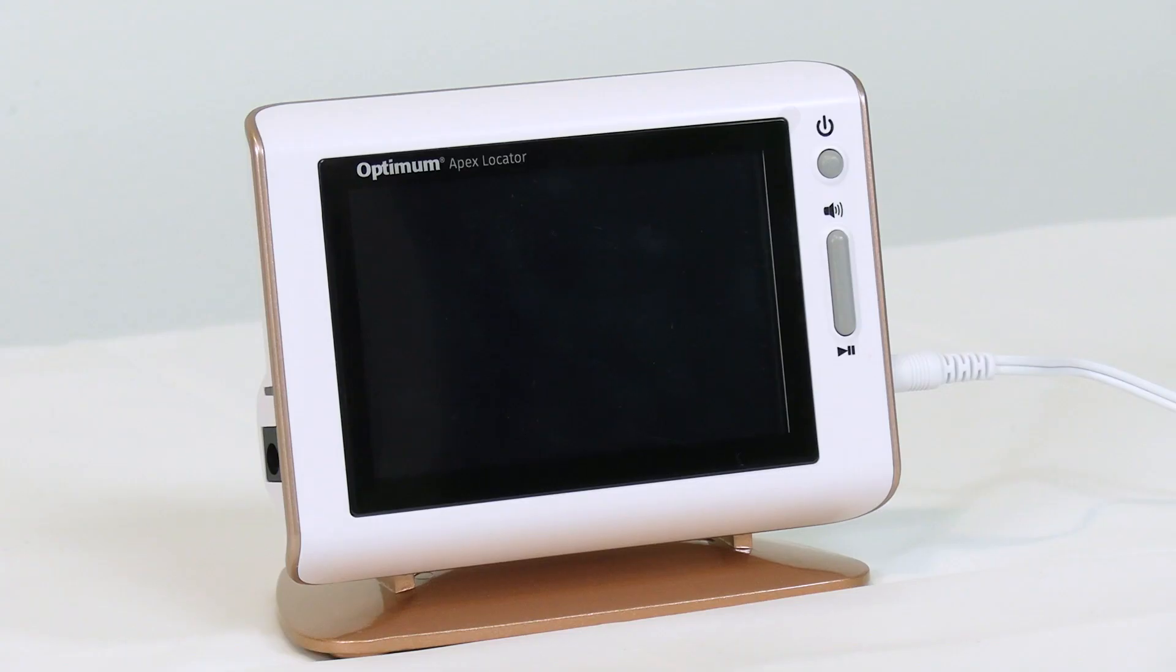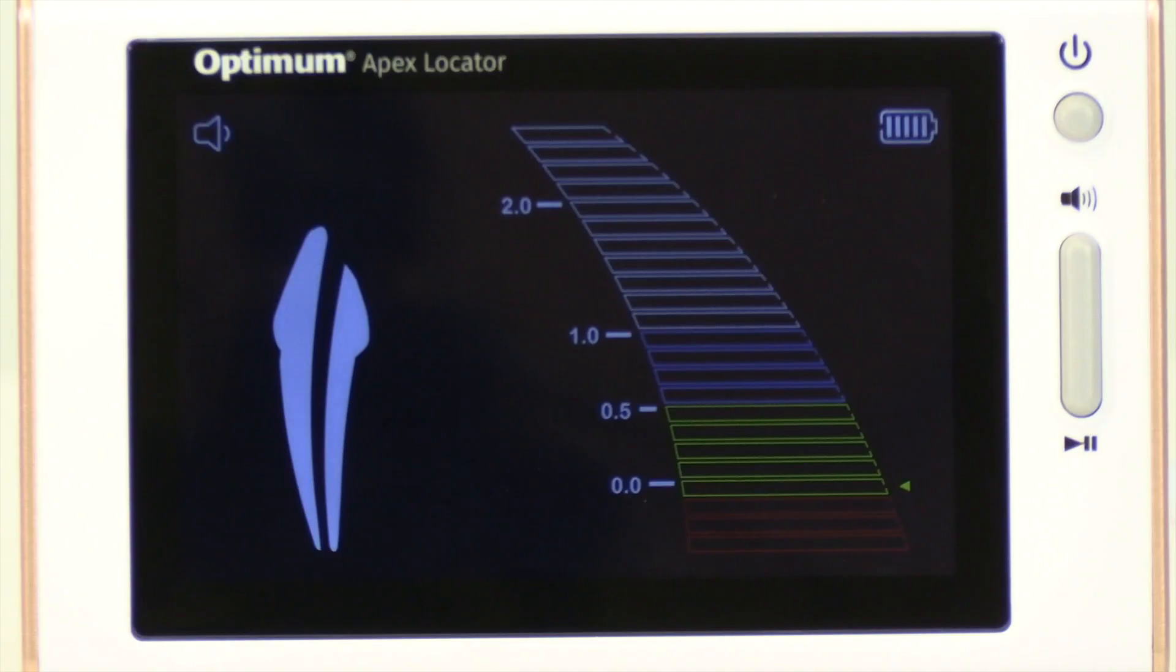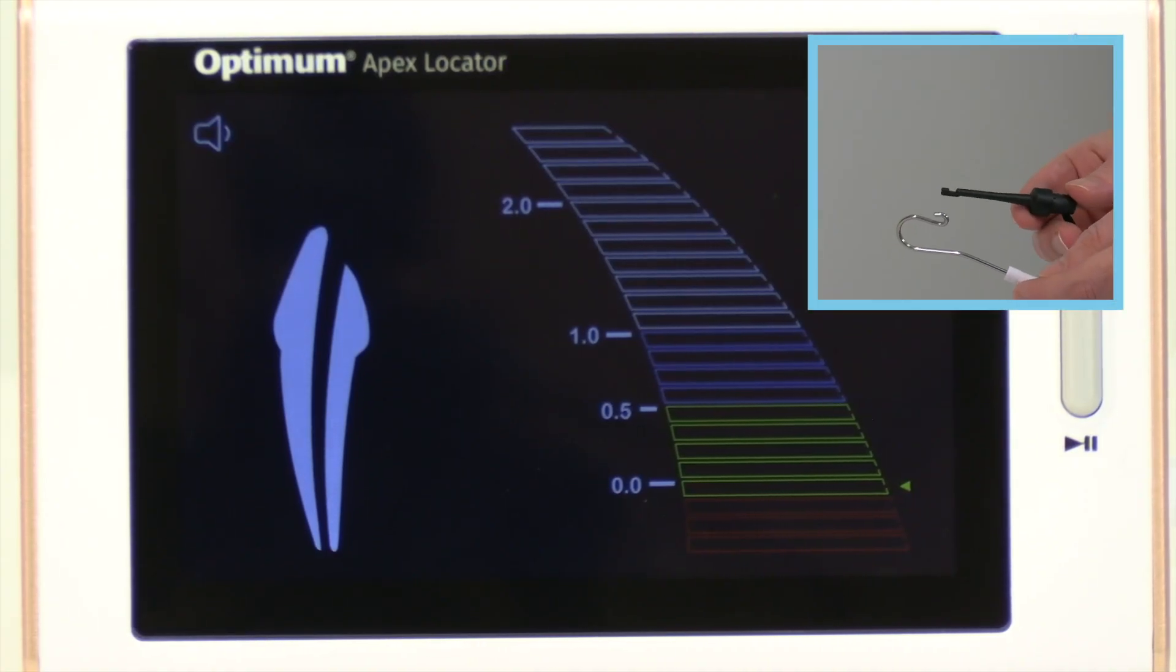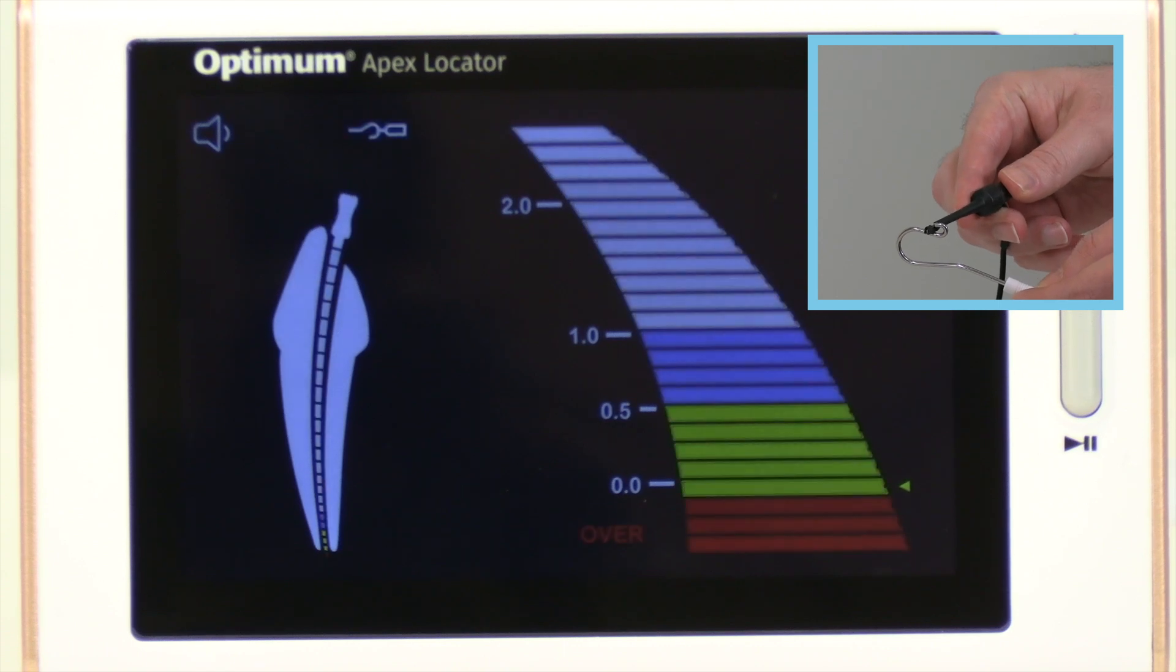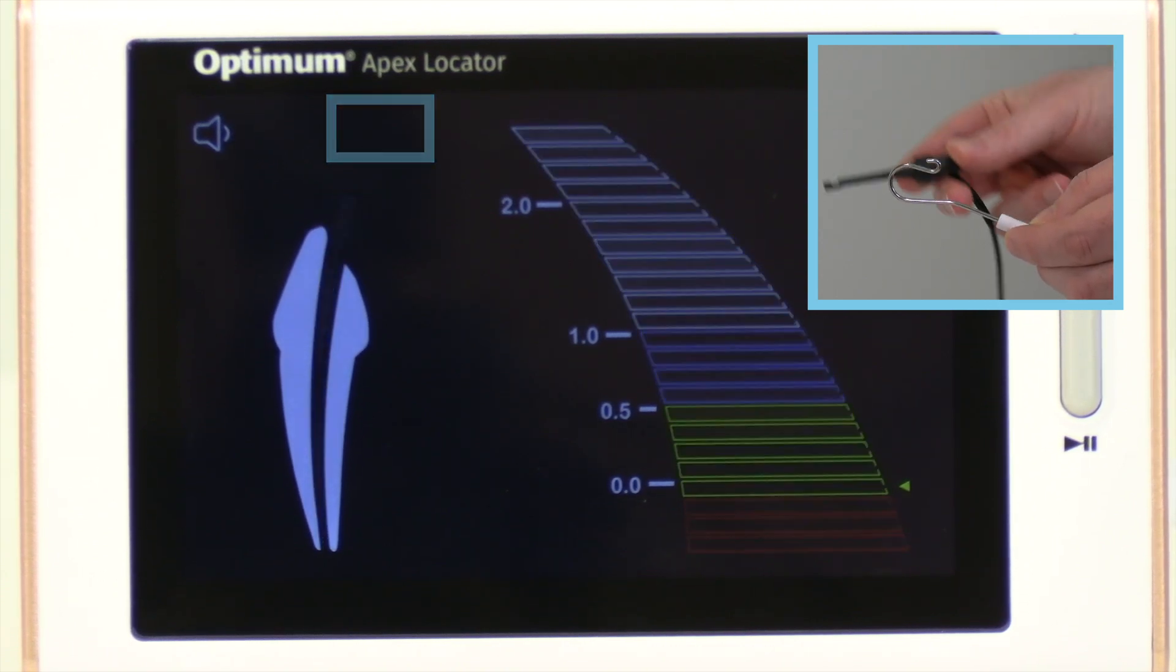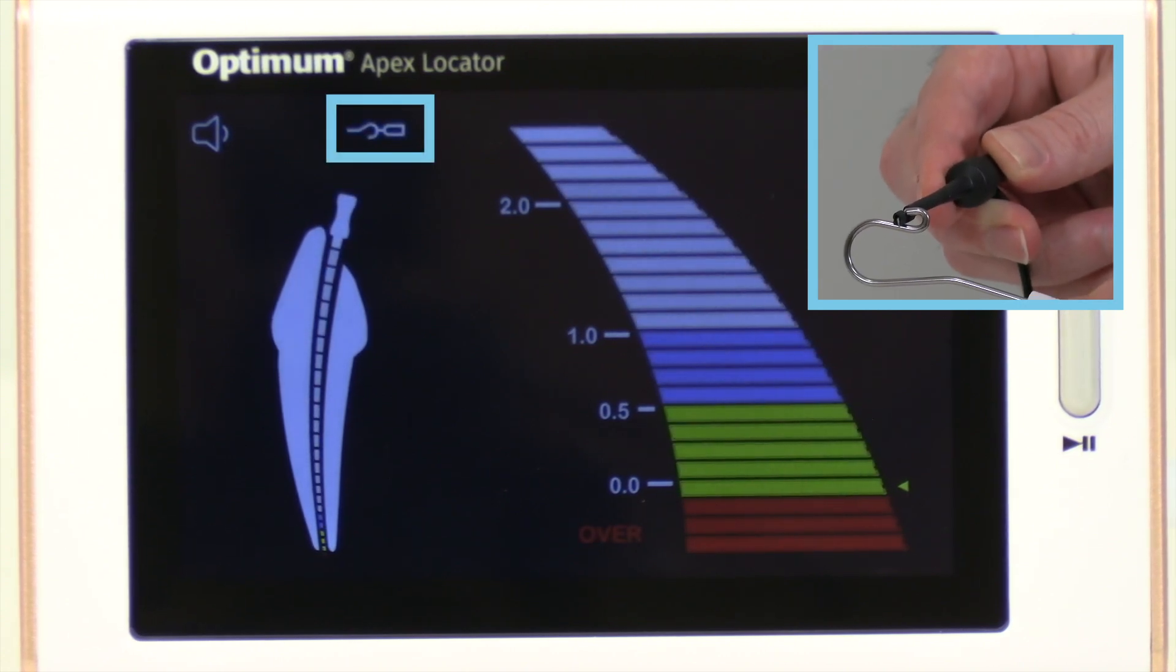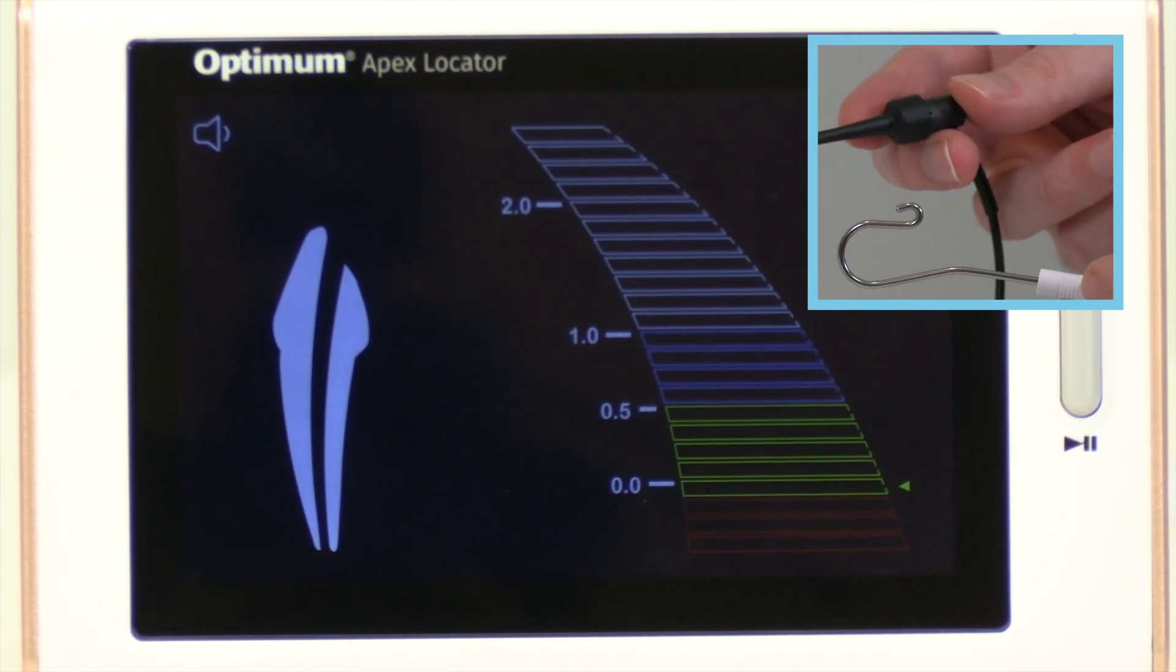To confirm the file clip and measuring wire are in proper contact, turn the unit on and then touch the lip hook to the bent wire of the file clip. Check to ensure the connection icon is displayed on the LCD screen. If the icon is not displayed, the measuring wire may be damaged and should be replaced.